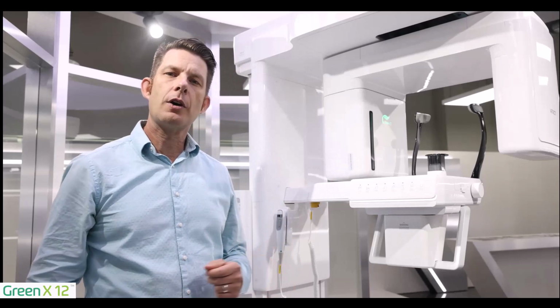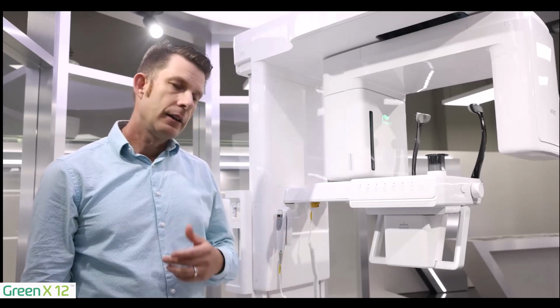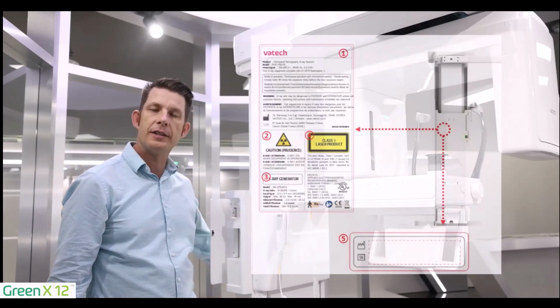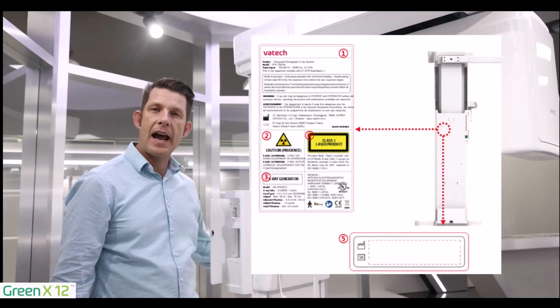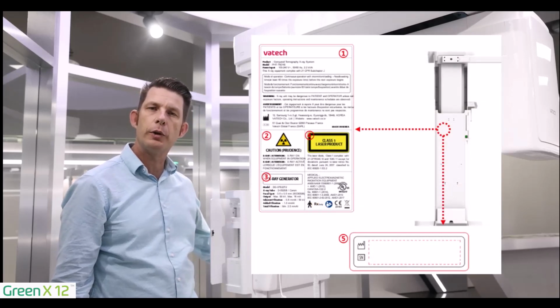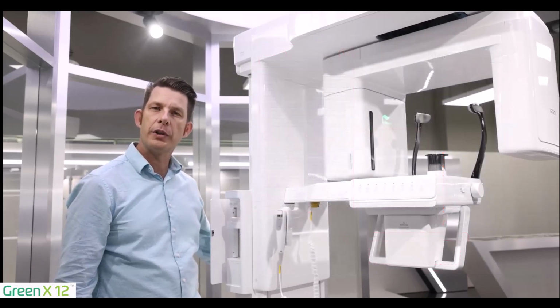One last thing we want to talk about is the location of the serial number of your device. The serial number is on the rear column and starts with a 3-digit 0, 2 numbers, and a dash. If you do need to call in for service or talking to education, we want to make sure you have that available for our technicians when you do call.